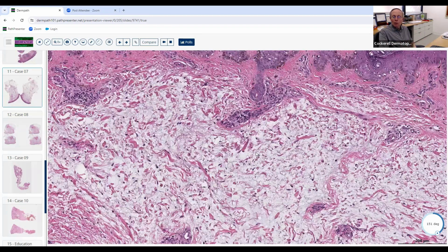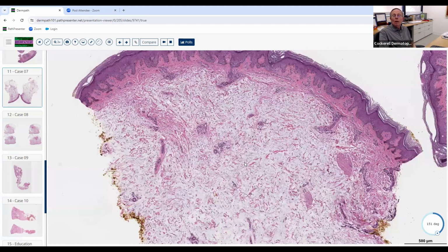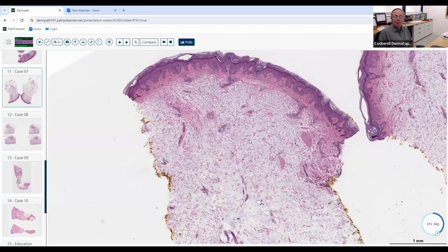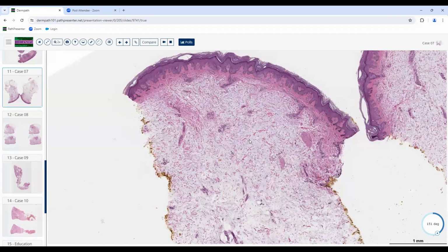Okay, so what's your differential diagnosis here? At the top of my differential, if anatomically it fits, would be pretibial myxedema. Good. I would also think of other mucinoses like scleromyxedema or scleredema. Now let's talk about those two. Would you ever get this much mucin in scleredema?